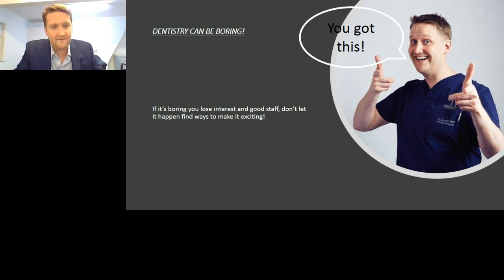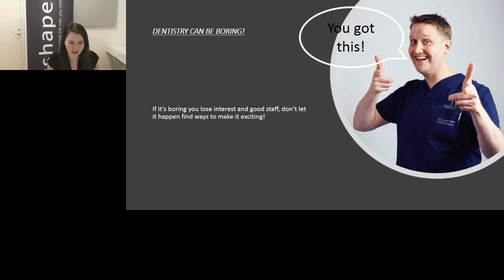I think there really is high value coming out of recording that sequence of motion, because like you said, it does reduce the scanning time. You can go with a quadrant when in the past you should have probably taken a full arch just to be able to locate it the right way in the virtual articulator. Of course, in the design software itself, you can still work with the virtual articulator even if you have the recording there, so you can still choose either one of the functionalities. But I think it's a brilliant new feature that works really well. Yeah, exactly.